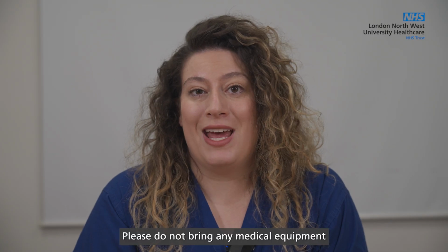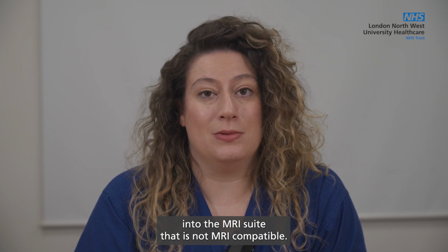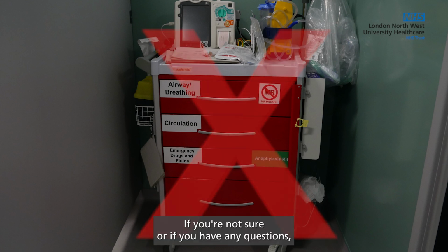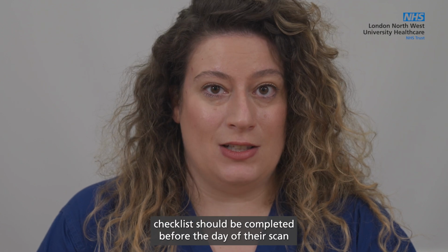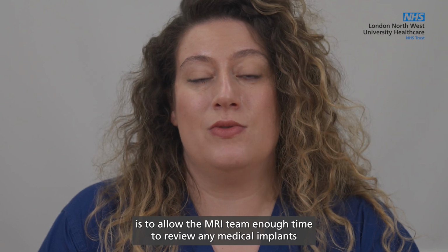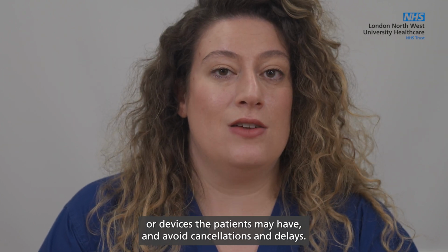Please do not bring any medical equipment into the MRI suite that is not MRI compatible. This includes the cardiac arrest trolley. If you're not sure, or if you have any questions, please ask your MRI radiographer. The reason the patient's MRI checklist should be completed before the day of their scan is to allow the MRI team enough time to review any medical implants or devices the patients may have and avoid cancellations and delays.